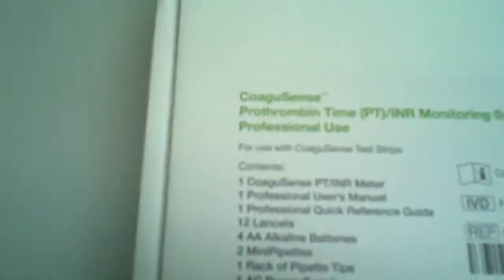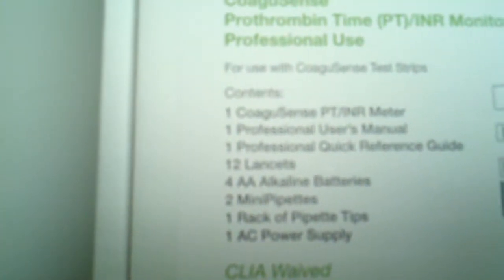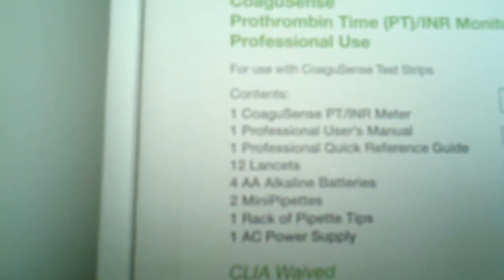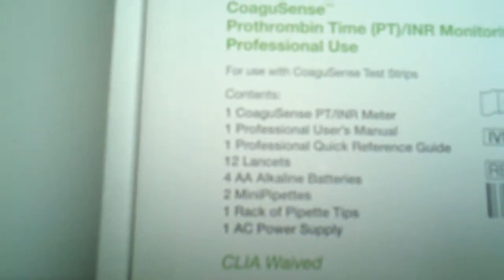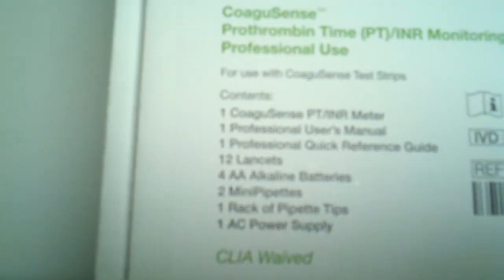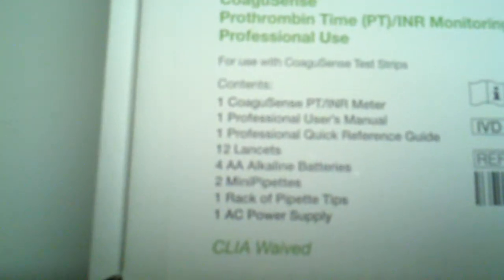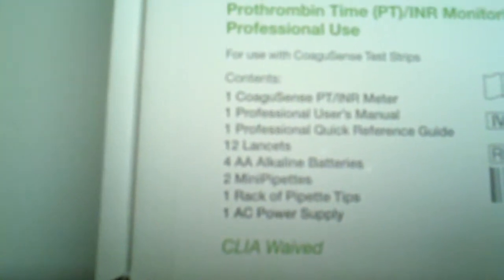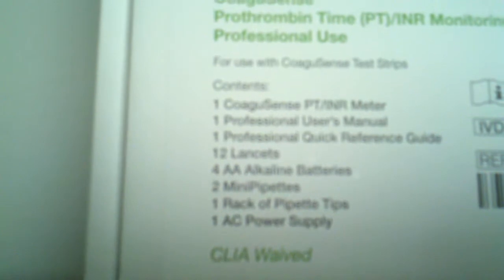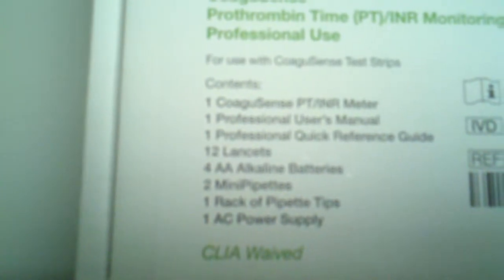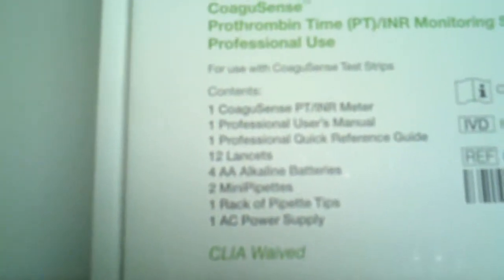With that said, I'm going to open this up. You can see I'm going to show it closely here. It includes the meter, the manual, the quick reference guide, 12 lancets, four AA batteries, two mini pipettes, one rack pipette tips, and the AC power supply. And it is CLIA waived.